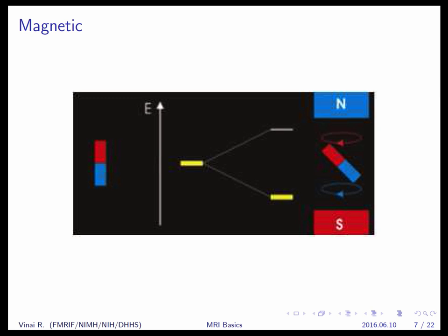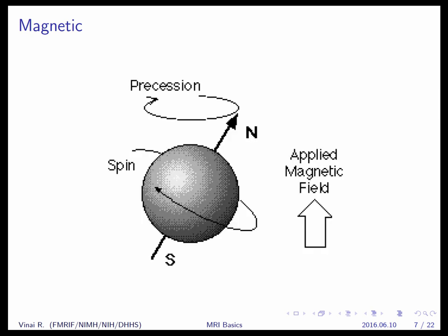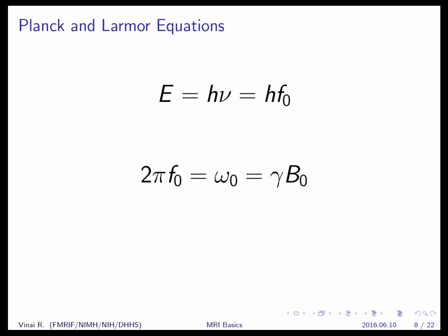Sorry. No. Not at all. Okay. So now, going between the two energy states where the hydrogen atom is either aligned or anti-aligned with the magnetic field, there's an energy gap between those.